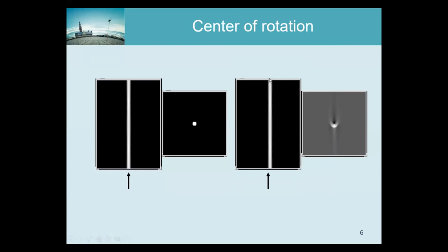And then you would get a result like that. So the gamma camera would be here, would rotate, and because this thing is really on the rotation axis, the projection would always be at the same position in the camera. But it could be that that camera actually stores that signal, not in the center of the row, but a bit to the right, as shown here.